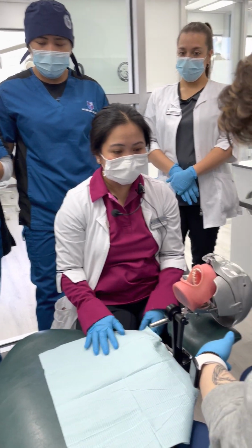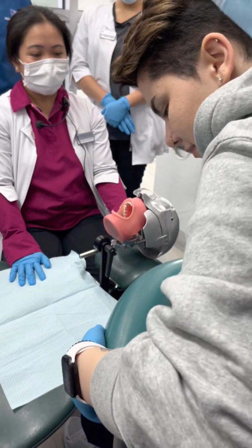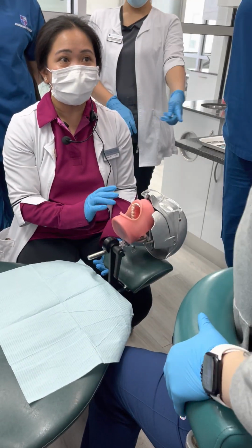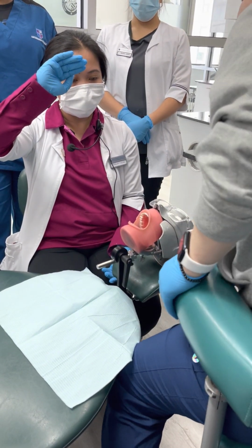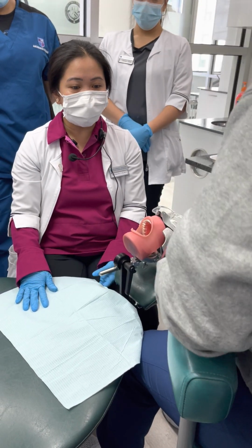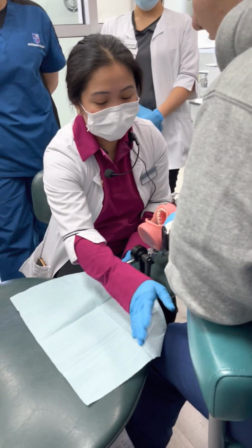Now, the way she's sitting, is it correct? Do your feet fit there? Okay, you have to be higher. I know you're taller than me already, but basically you have to be higher than the dentist. The handle is on your right side, and up. The chair will swallow those who don't know how to operate it. So you're going to disappear.